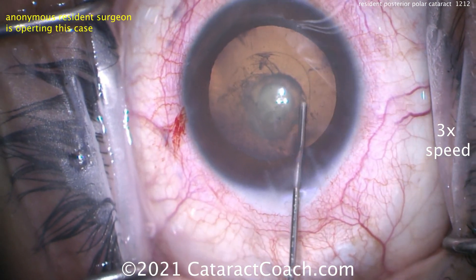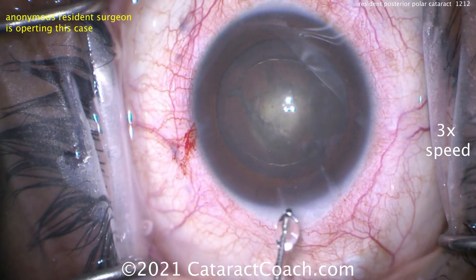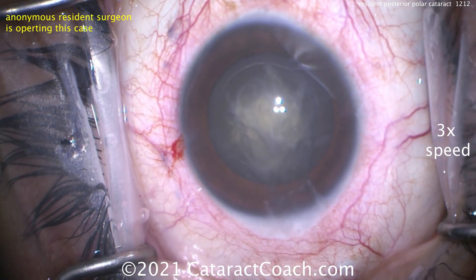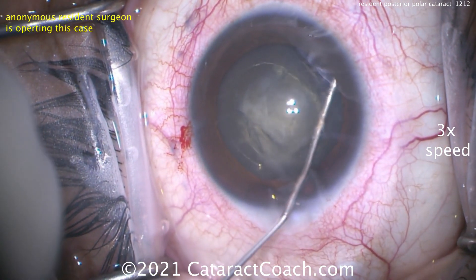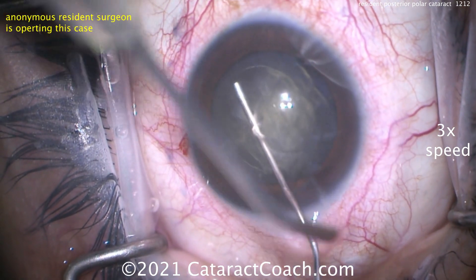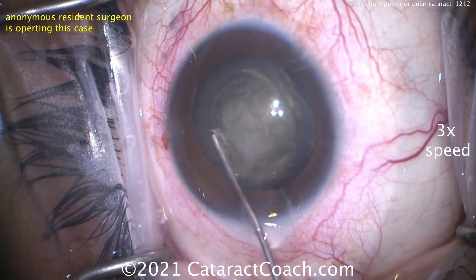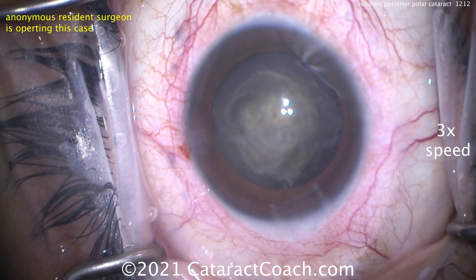The key: do not do hydrodissection. Hydrodelineation is the key — there's the golden ring. Only delineation, no hydrodissection. Because if you do hydrodissection, that fluid wave goes along the posterior capsule, gets to that posterior opacity, and pow — it splits the capsule wide open. That's how you run into trouble. Instead, we'll do just hydrodelineation. That yellow dispersive viscoelastic — I'm doing a visco-dissection, which is different. It's between the capsule and the cortex, and it's slow motion.